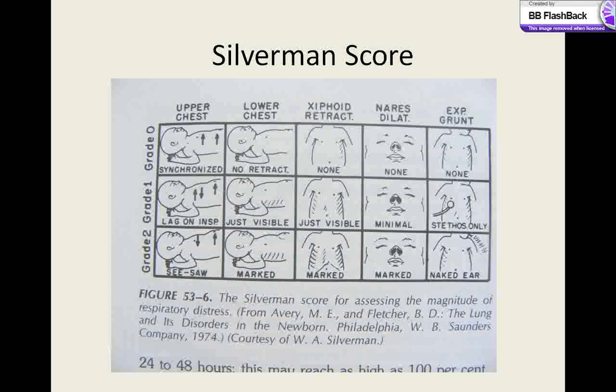Silverman score provides subjective assessment of respiratory distress. Worsening of score suggests inadequate CPAP pressures which will require further intervention.